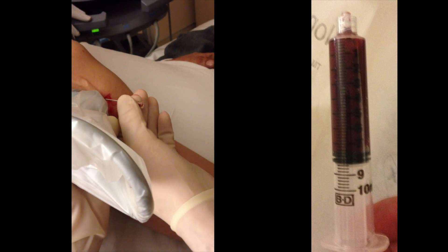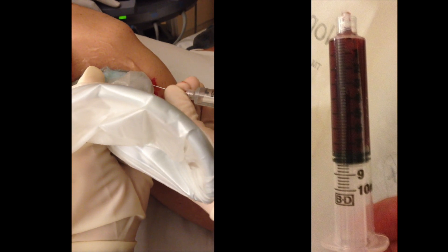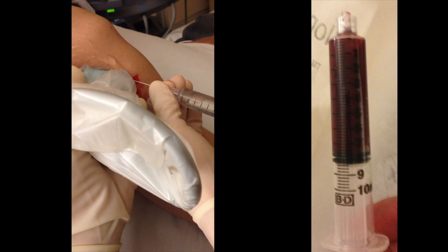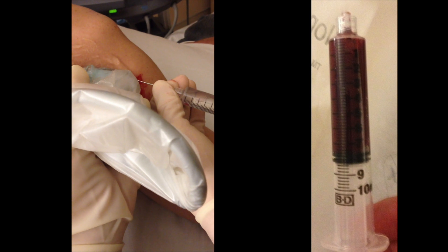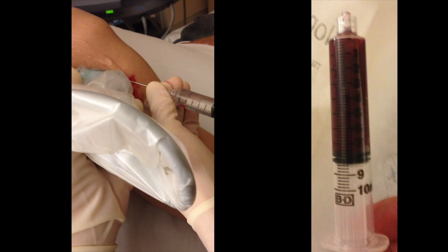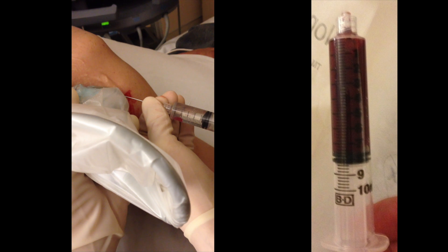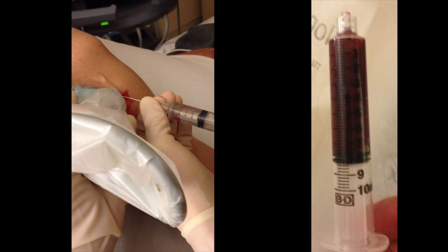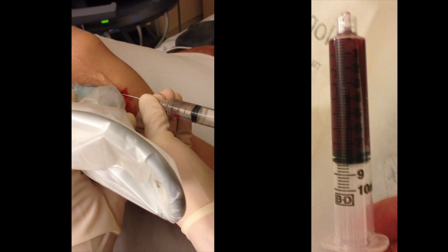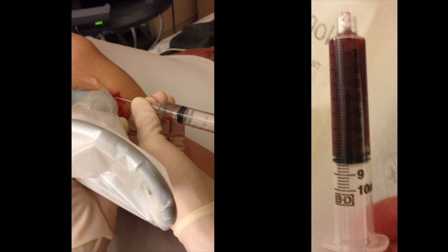We got about eight cc's of fluid out, and then we'll take that off, leave the needle in the joint space, and now we're going to take the sterile lidocaine. I usually like to aspirate just a little bit more — you'll see a little flash of blood come in just to make sure I haven't lost the space — and then inject that full 10 cc's. I've found that if I don't aspirate the hematoma first, it doesn't work quite as well for pain, because I think it distends the joint capsule too much. By doing this I have a lot more success.